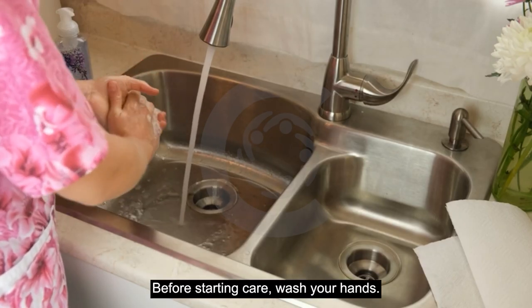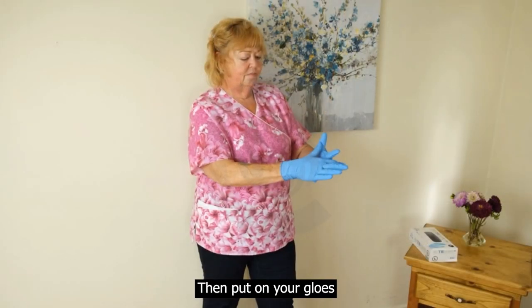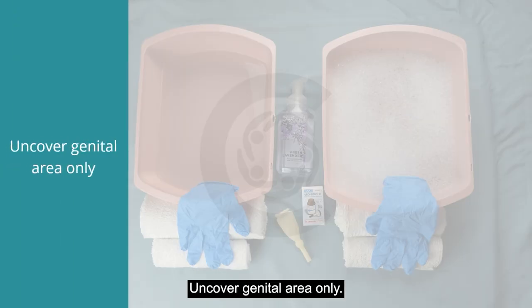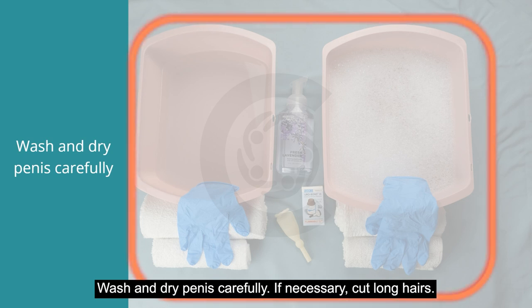Before starting care, wash your hands, then put on your gloves. Uncover the genital area only, wash and dry the penis carefully, and if necessary, cut long hairs.